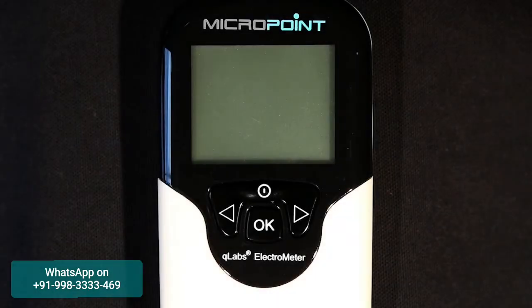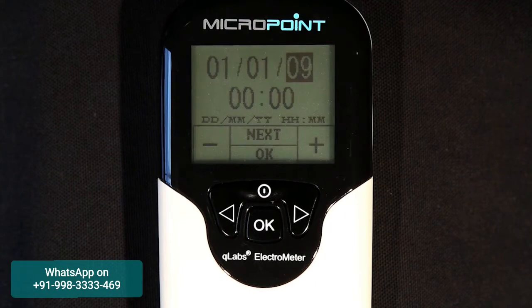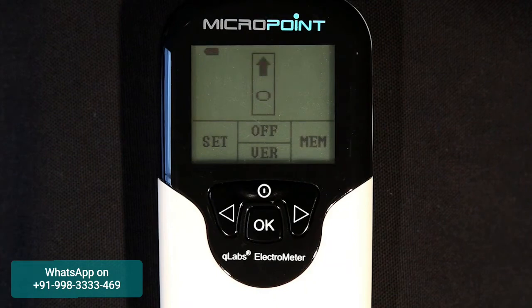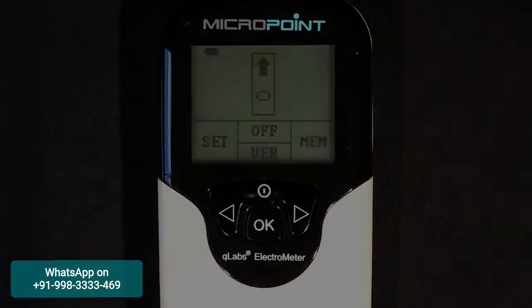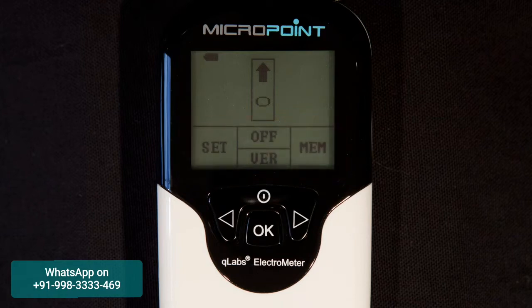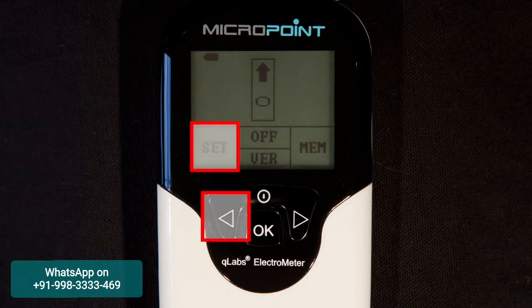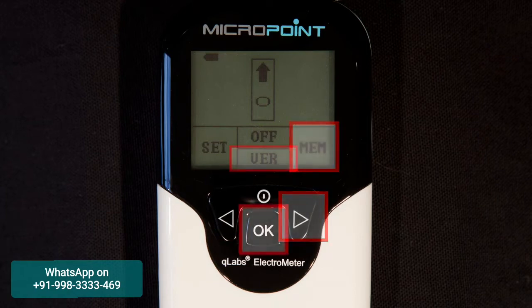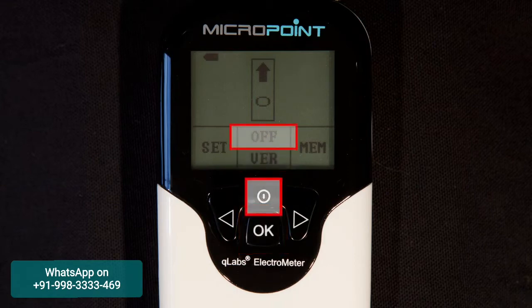When the Q-Labs Electrometer is initially powered on, it will beep and automatically enter the setup mode. In the setup mode, you can change the Q-Labs Electrometer settings, or press the OK button to bypass the setup menu to reach the home screen. You will notice a grid on the lower portion of the LCD screen indicating which buttons coincide with functions that change as you walk through the interface. For example, the left arrow will enter the settings menu, the right arrow will recall stored test results in memory, the OK button will display the firmware version, and the power button will turn off the Electrometer.